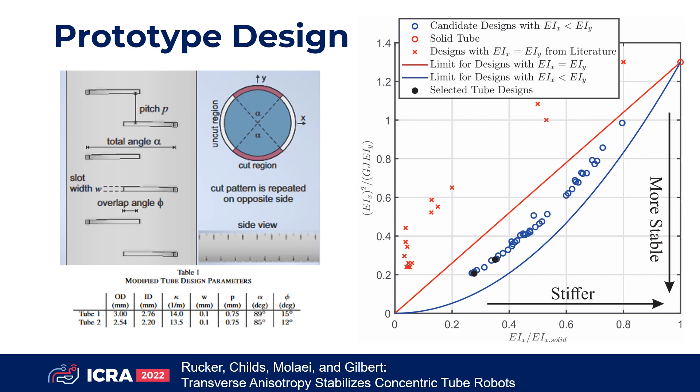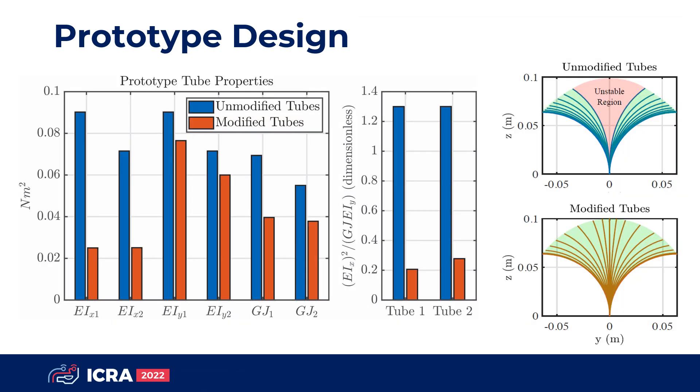We designed a prototype with a pattern of cutout regions that reduces EIX more than EIY. All of the parametric designs that we studied resulted in tube pairs which exceeded the theoretical performance bound for all prior approaches and came close to a theoretical bound for anisotropic designs. Our prototype tubes were designed with equal stiffnesses and curvatures in the X direction, enabling the tubes to fully straighten. The stiffness in Y and in torsion were kept high, and the stability parameter is reduced by a larger factor than any of the individual stiffness reductions.